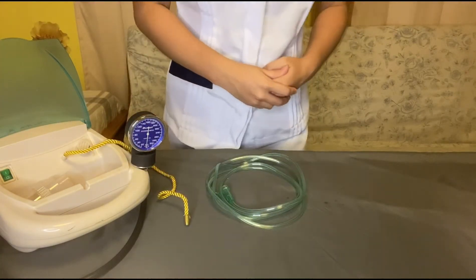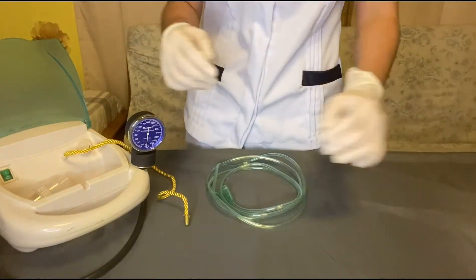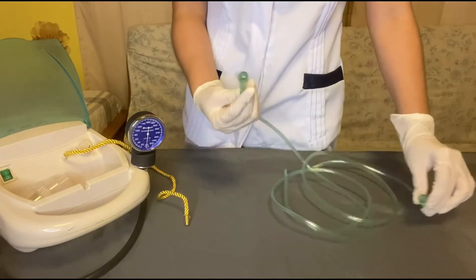Then wash hands correctly and wear gloves. Next, take the disposable suction catheter and connect it to the suction tubing.